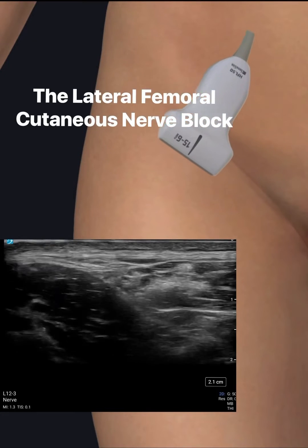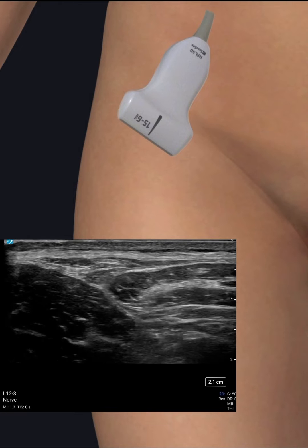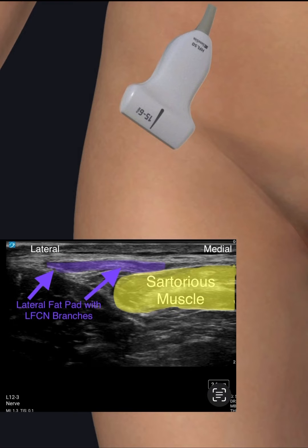The lateral femoral cutaneous nerve blocked by PNB school. The patient is scanned medial to lateral just distal to the femoral crease. The lateral femoral cutaneous nerve is identified lateral to the sartorius muscle at a depth of less than 1 cm, and may be branched at this level.